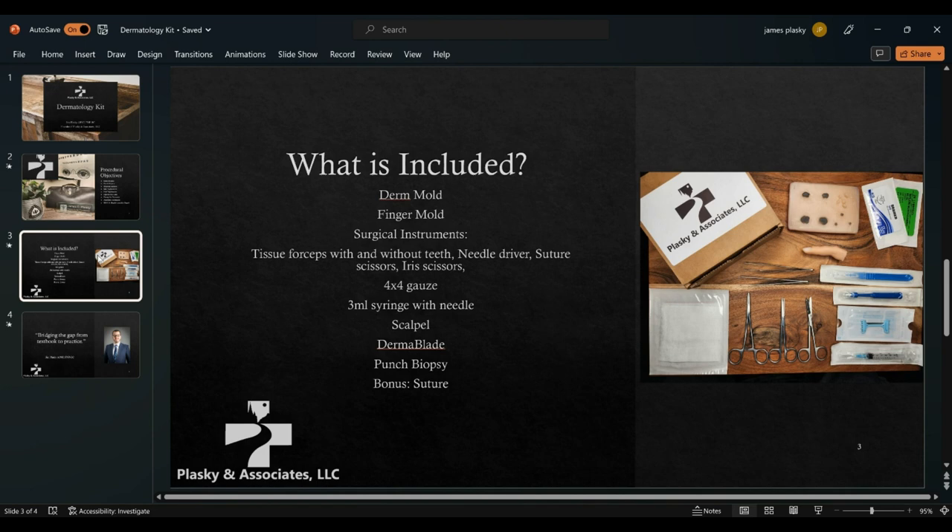The other supplies are peel-pack items — it was important to me to have options that mimic real-life instruments you'd see in clinical practice, such as the dermablade from Persona, which is not the easiest to come by but definitely the style you'll see most often. And then of course our punch biopsies and scalpels.